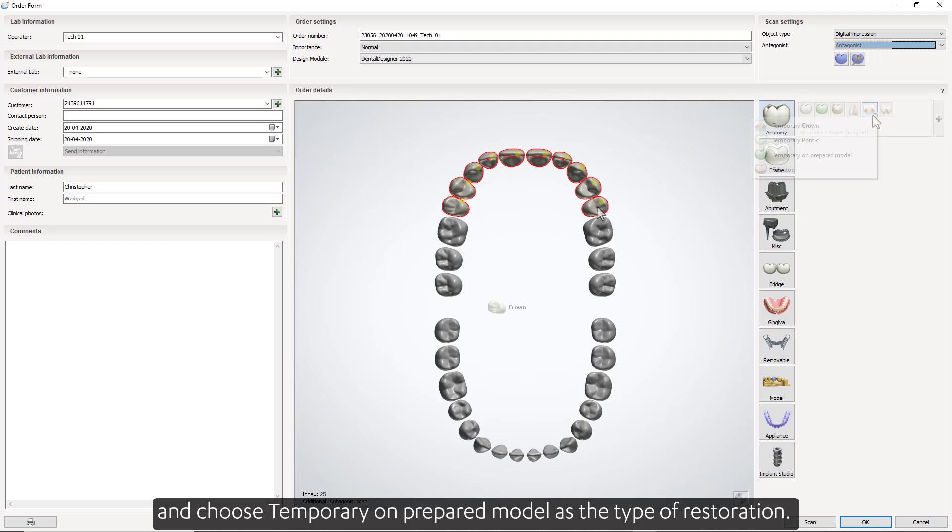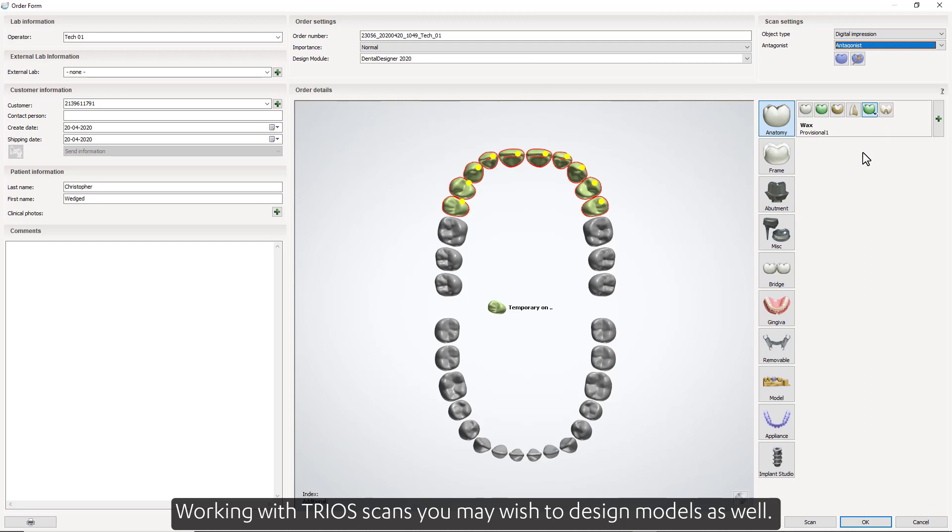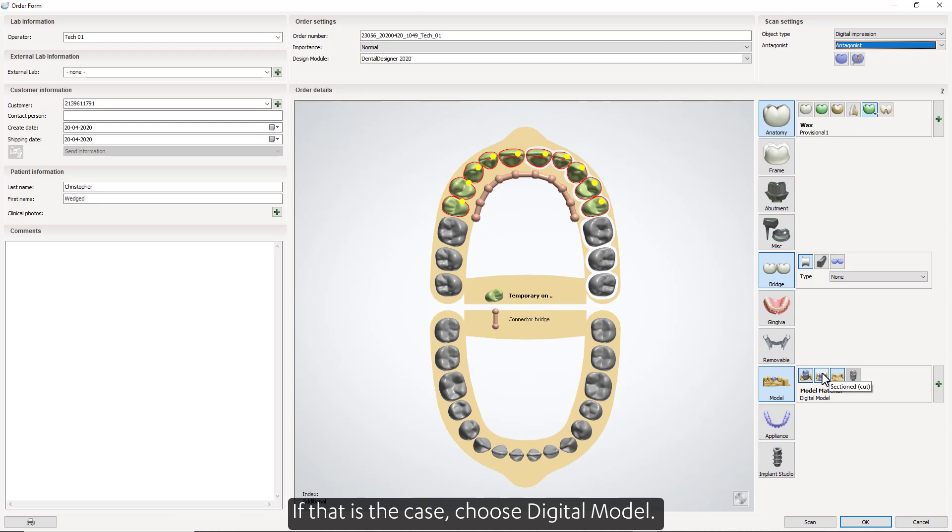Then select the teeth and choose temporary on prepared model as the type of restoration. Working with TRIOS scans, you may wish to design models as well. If that is the case, choose digital model. Then click OK.